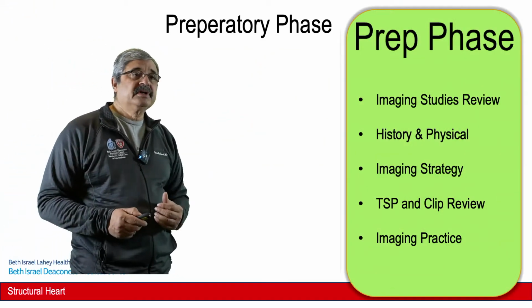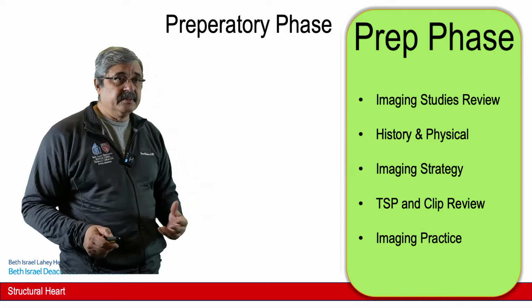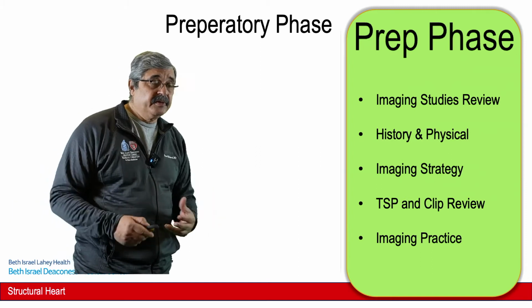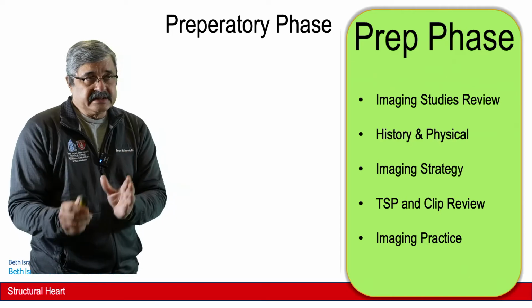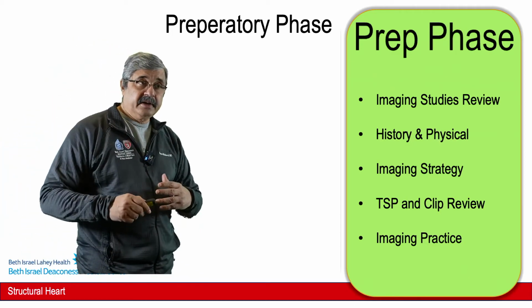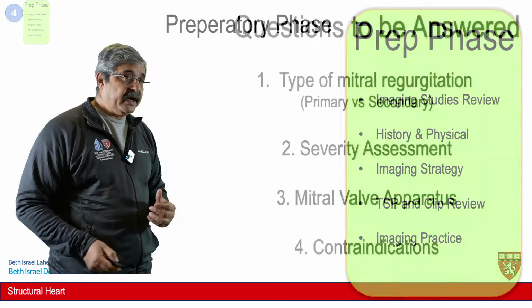Now comes the most important, the prep phase. That consists of imaging studies review, history and physical of the patient, imaging strategy, transseptal puncture and clip review: which side, how many clips, the location, presence of calcification, leaflet lengths. All these things have to be done in a heart team meeting that is done a day before the actual clip. And finally, imaging practice.